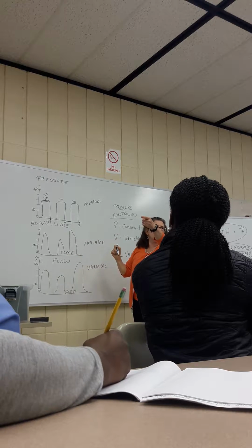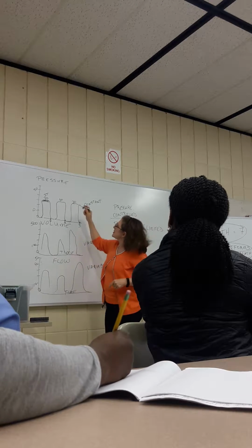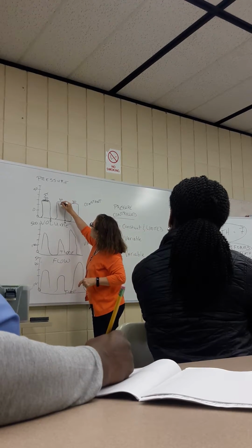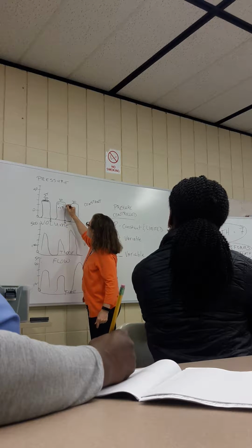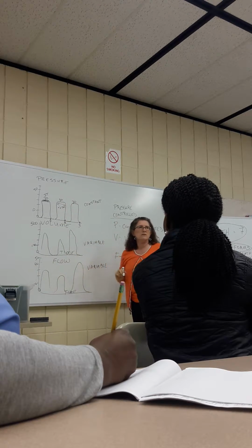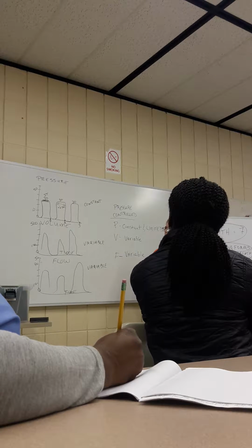Other than that, you look at the interface and it would tell you what your inspiratory time is. But I could look at this, and let's say the distance from here to here is 0.6 seconds. So I could get that information from that scalar.